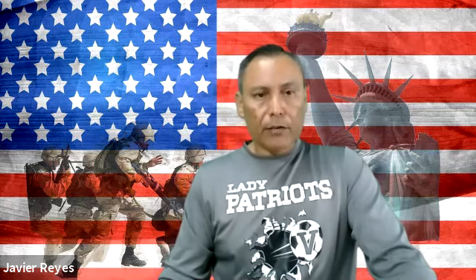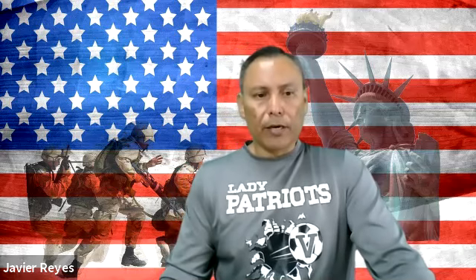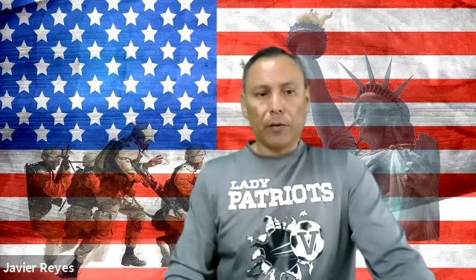So, yeah. The ESR is done commonly for older adults that have arthritis. Okay, it measures their rheumatoid arthritis or inflammation in their body, and that's when the doctors will try to increase their medications for pain or inflammation and so on. So this is again a very common test. Remember, it's ESR, so you have to know what ESR is. EDTA specimens for reticulocyte counts are stable up to 6 hours. This one is not a common test, so you don't have to worry about that.